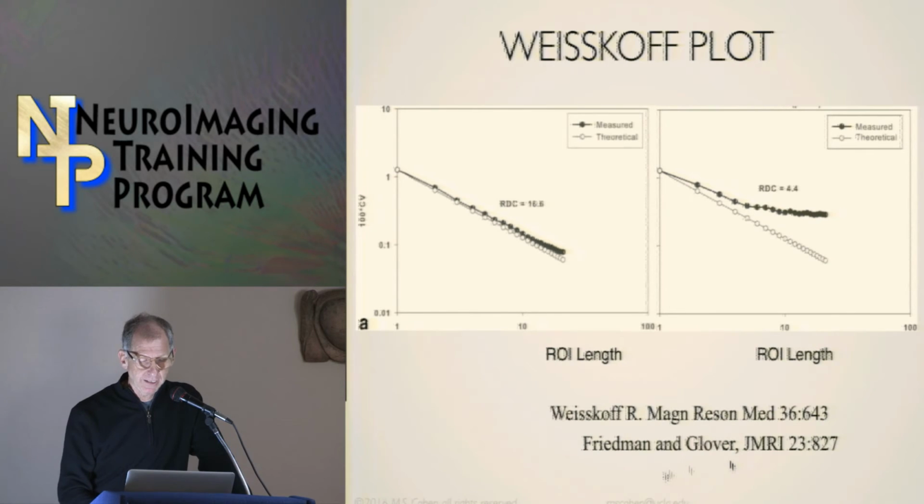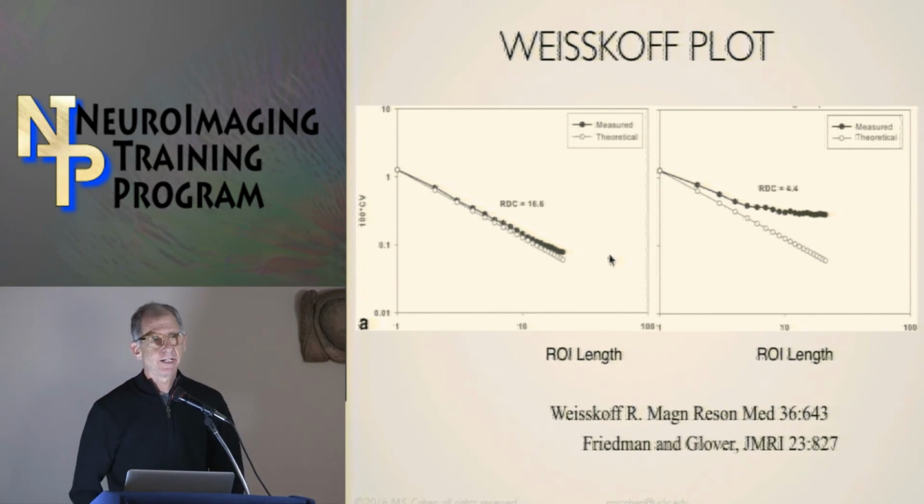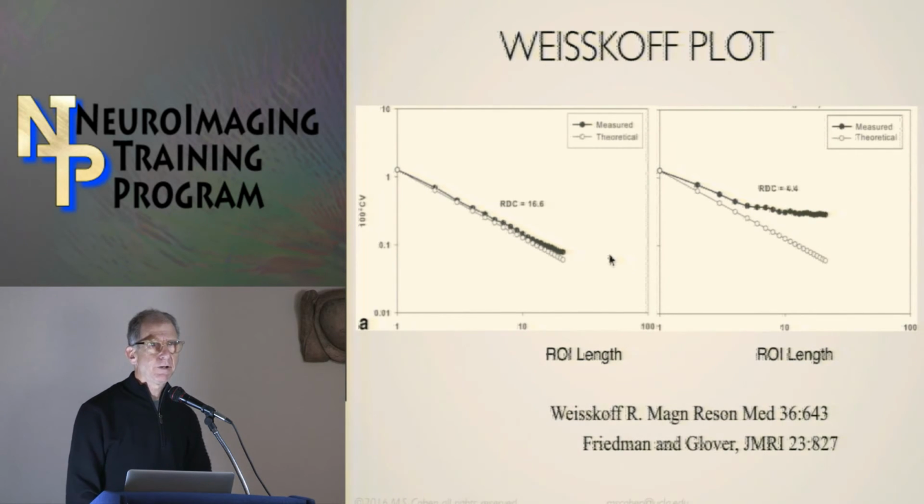So I showed you, for example, these two scanners, they're in a whole different world in terms of the signal quality and detection capability. And yes, you should be worried about it. And other things, like if you're heterogeneous with field strength, you have both a heterogeneous SNR and heterogeneous relaxation rates. The T1s become increased as you go up in field, so the same TR gives you different contrast. The usable T2s go down as you go up in field, so the same TEs give you different contrast. And then the different vendors.